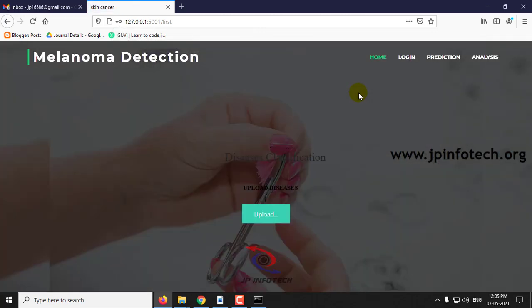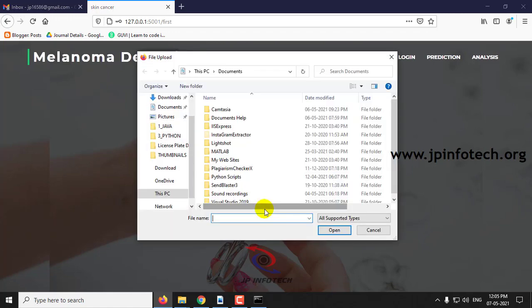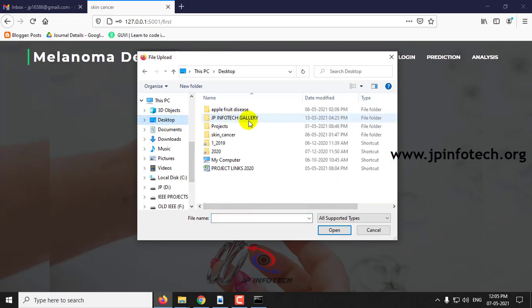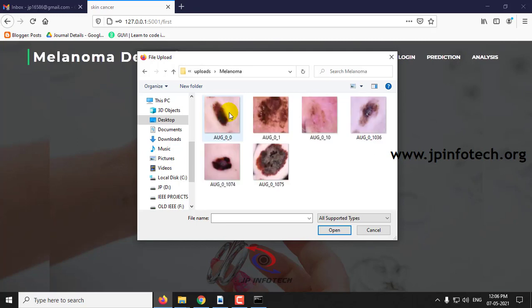Once the login is successful, you can see the option of uploading the image. Click upload. In uploads, you can see we are given datasets of melanoma or not melanoma. Let me show you with the melanoma first.